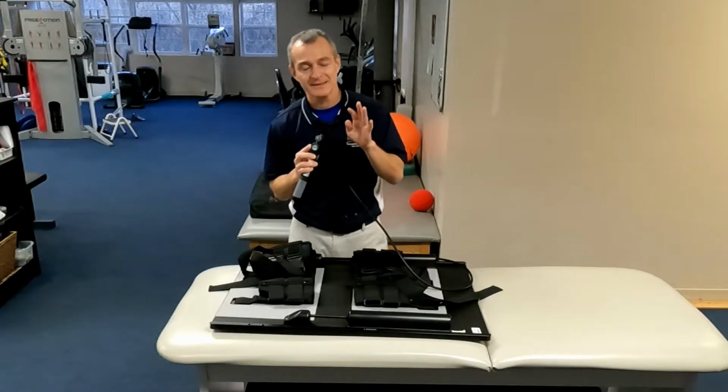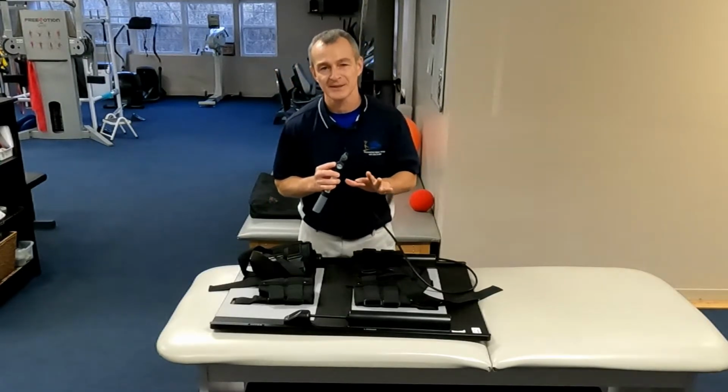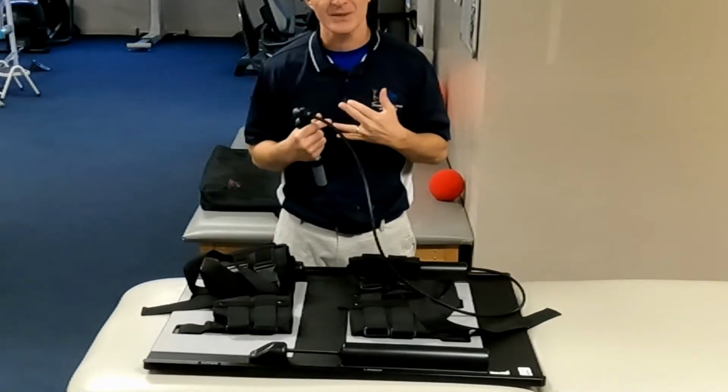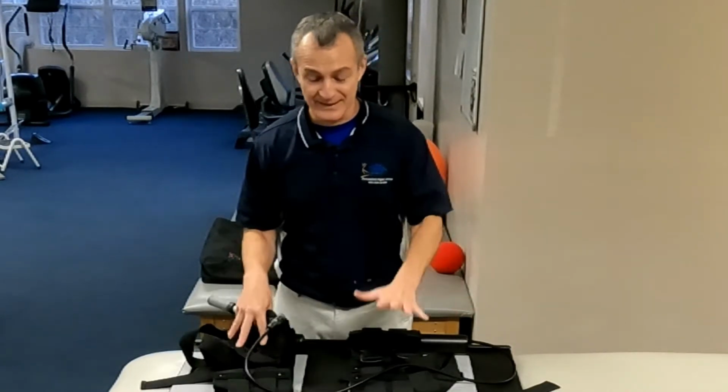But I want to talk about that because there's a misconception about what lumbar traction actually does. In my world as a physical therapist, I'm not trying to overcome muscle guarding, muscle tightness. I'm not trying to rip the person in half. What I'm trying to do is provide a gentle traction motion. Now, there are lots of ways to accomplish that, both positionally, laying in different positions, attaining different postures. This just gives me another tool in the toolbox that allows me to do it differently. I always say I could hammer in a nail by smashing it with a rock, or I could use a hammer, or better yet, I can use a nail gun. This is like the nail gun.